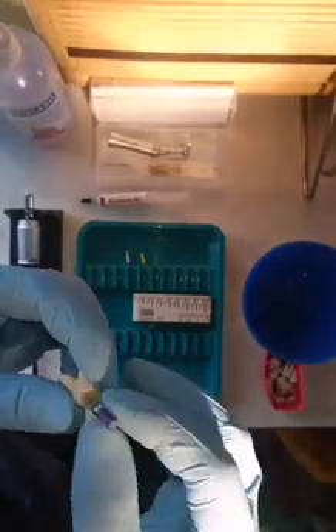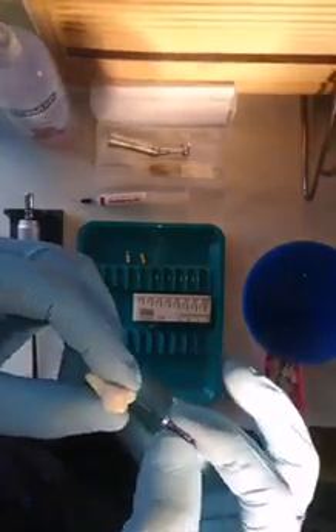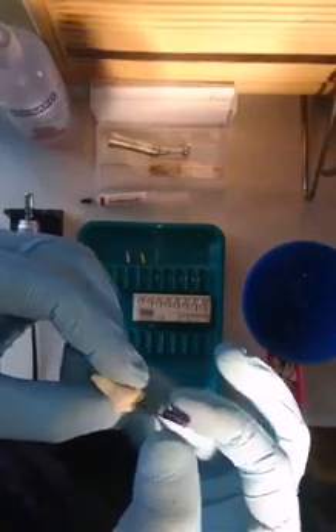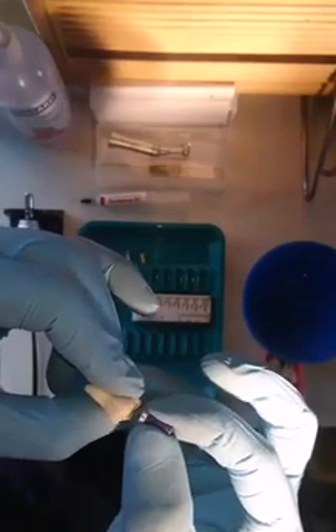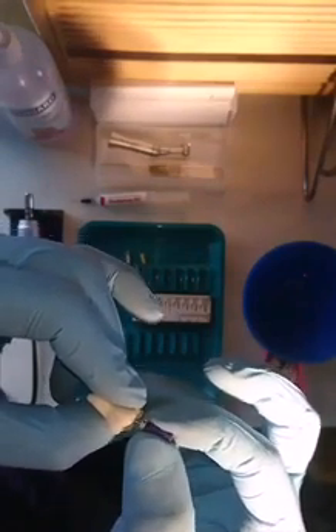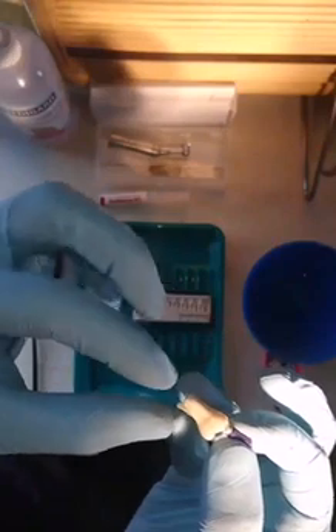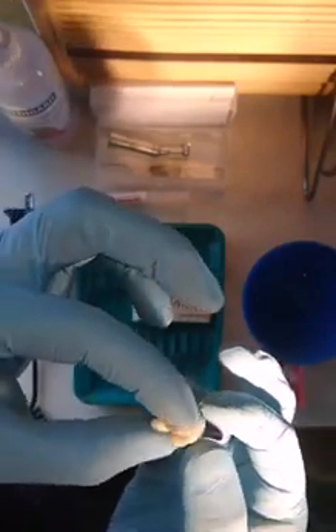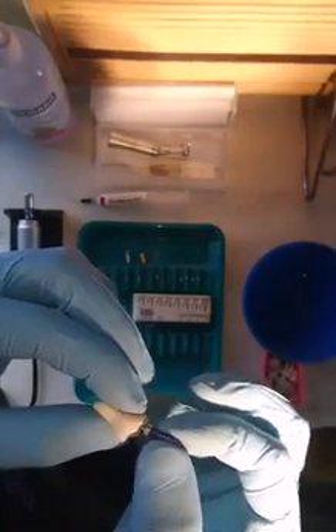So what we have here is where I would be inserting this hand file into the palatal canal. My motion is a watch winding motion where I gently pass through. I've felt the resistance and it's understood that this has gone out of the apex, which would be confirmed in a patient using an electronic apex locator. Now patency first has to be achieved.